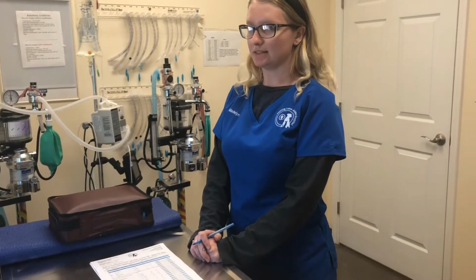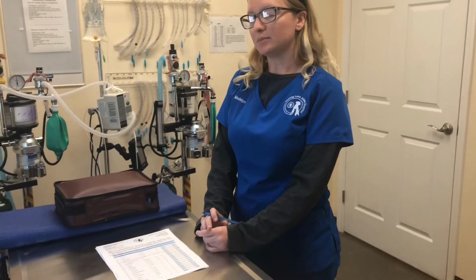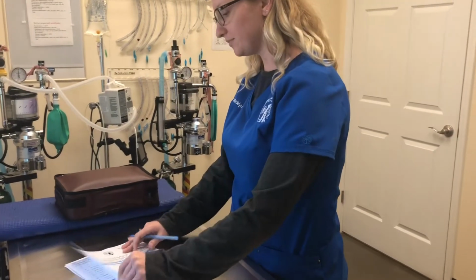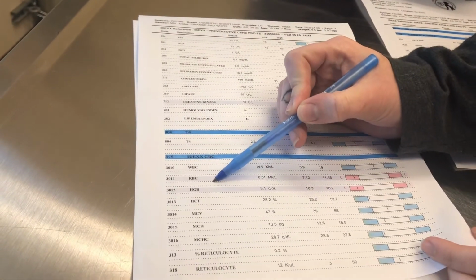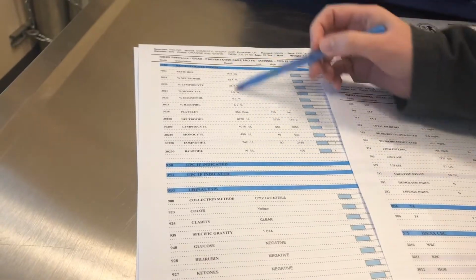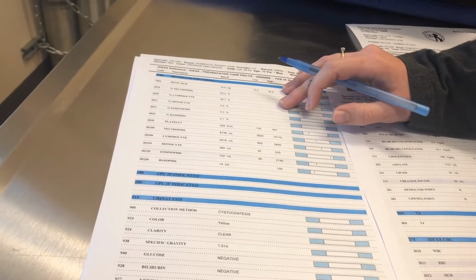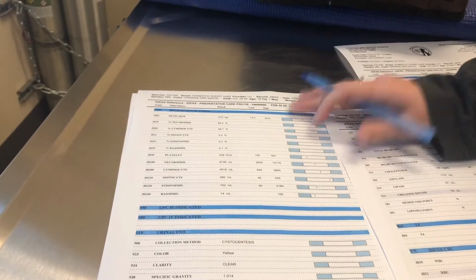Okay, now we will discuss the databases that we use to prepare our patients for anesthesia. The minimum databases required are a CBC, which an example of is right here. This evaluates mostly white blood count, red blood count, and platelet count. It also evaluates hematocrit, so super important. It also continues here for any patient to go under anesthesia that we know their clotting ability of their blood, infection, possibilities of infection, inflammation, that sort of thing.